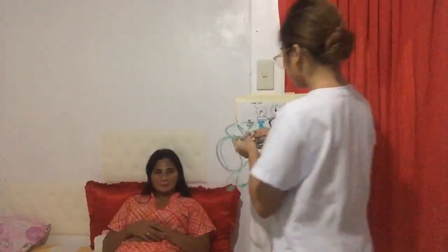So we have here our tank. Our tank is where the oxygen is stored. We have our humidifier to prevent the nasal cavity from being dry, as it humidifies the flow of the oxygen.